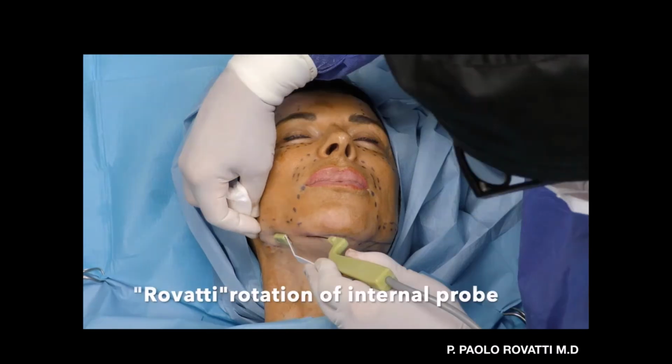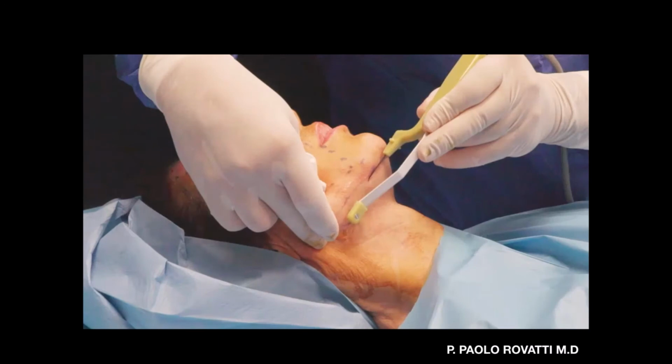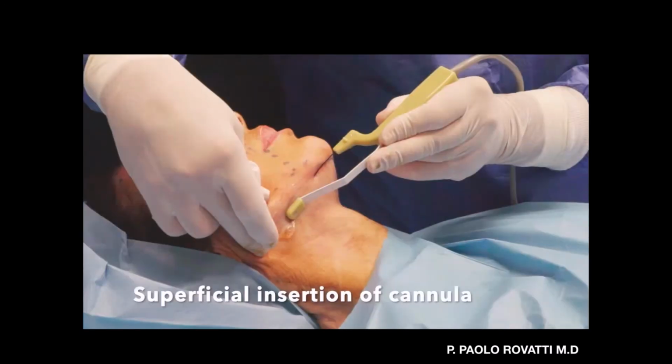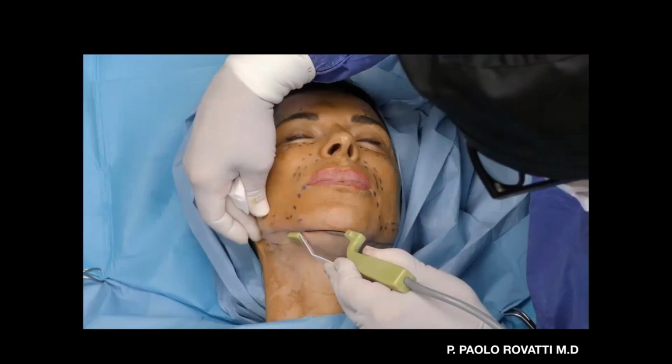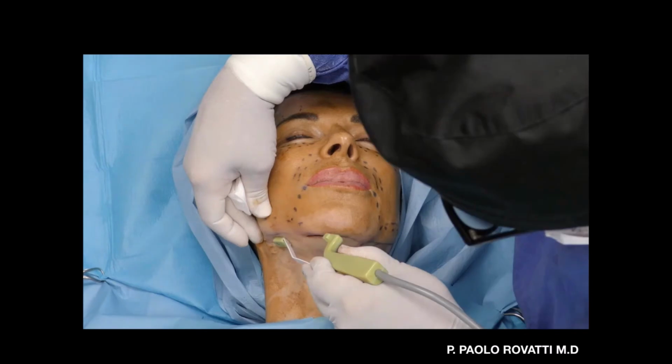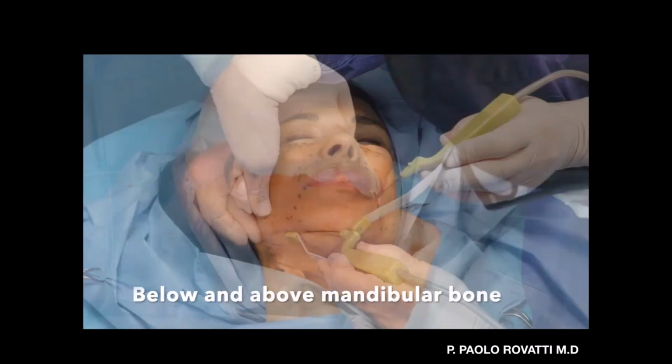So I'm putting the probes just towards the bones. And look, my cannula is superficial, and I'm treating this area. At this point, where there is a lot of fibrous subcutaneous tissue, you can stop because this is safer. And you have a stop technique in some places where you want to fix. But I will show you after, because there is a different subcutaneous layer. And this is just above the jaw.